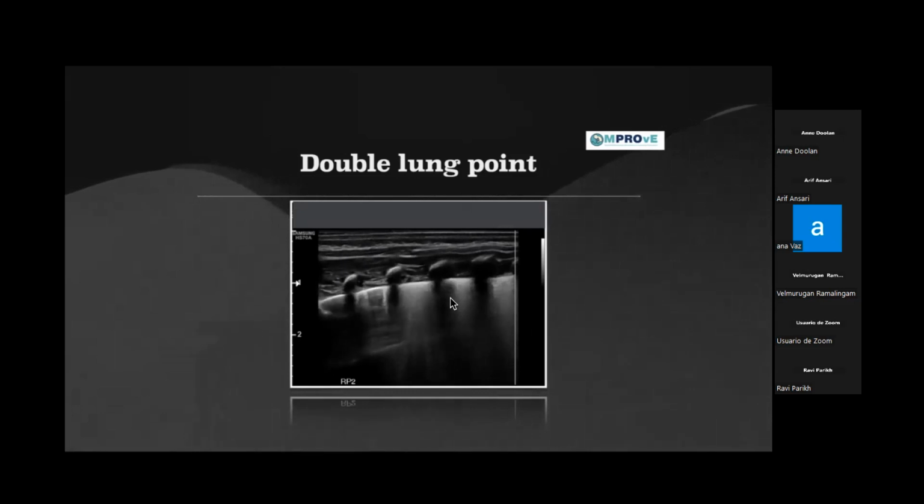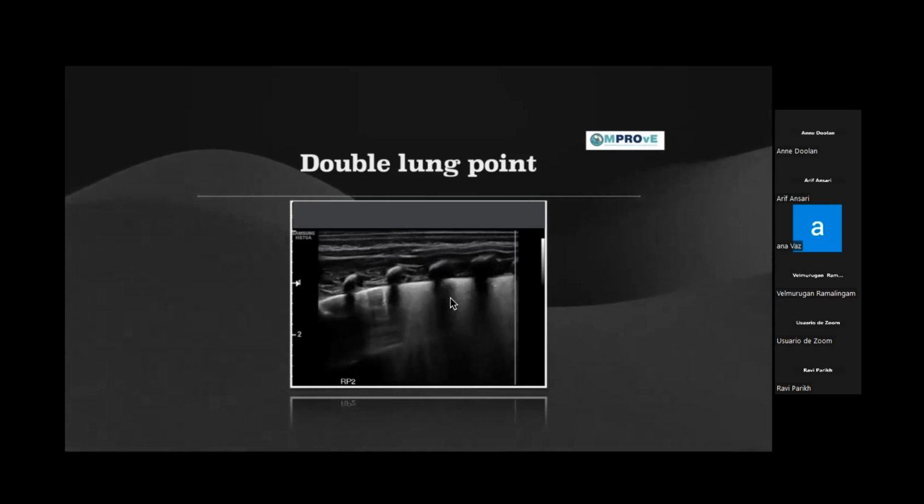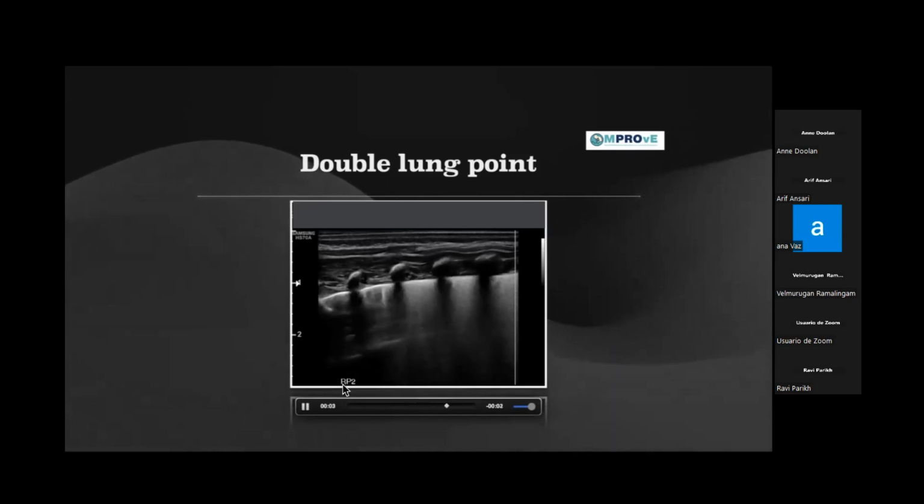Say you are doing R1, R2. I'm sure Alok must have gone through the topography of the lung and how you name different zones of the lung. There's a small variation depending on which part of the world you are, but it's pretty simple. Whichever terminology or zoning method you use, in this particular baby, the baby is put prone, so right area, right zone, prone position, zone 2, so RP2. In that zone, I see two profiles here.